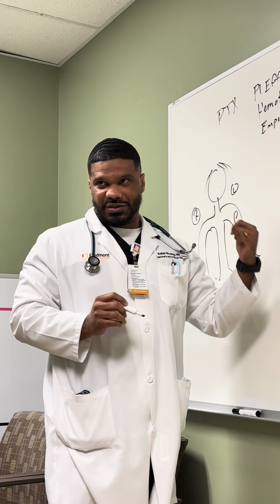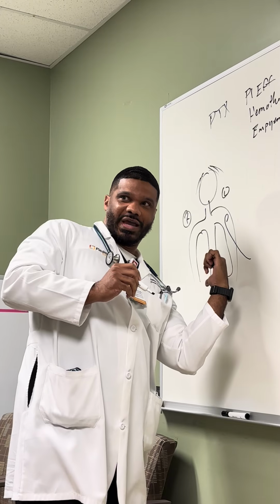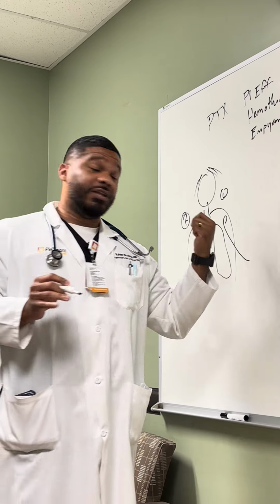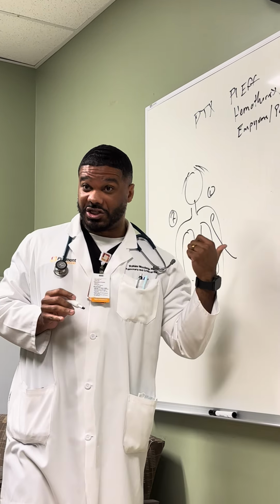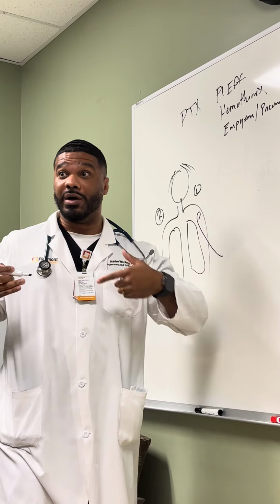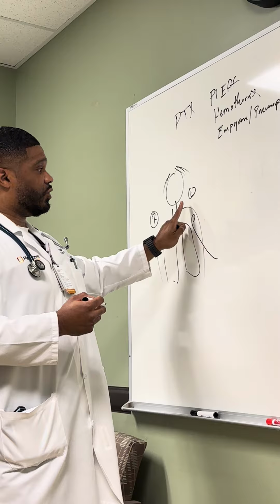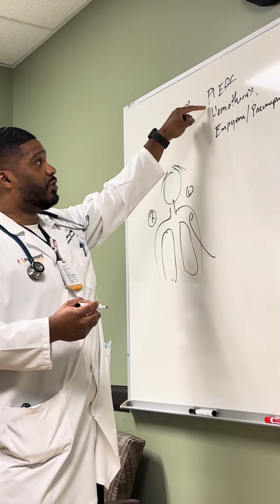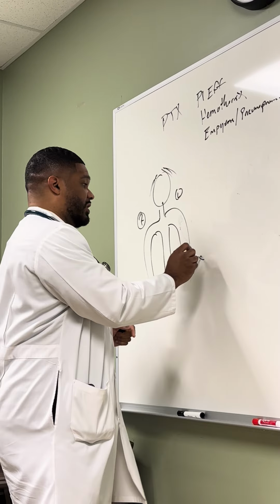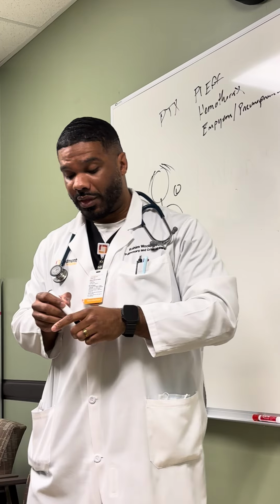A lot of times what you'll see is chest tubes being placed medially or they travel a little bit lower. I don't want to get too far into that, but I do want to bring this to your attention because this is something you can keep track of and look at moving forward when you start to troubleshoot. So with pneumothoraces, usually we like the chest tube up high, as opposed to pleural effusions, hemothorax, or empyemas, where we like to put the chest tube in the middle or even down low. We like to aim down low.